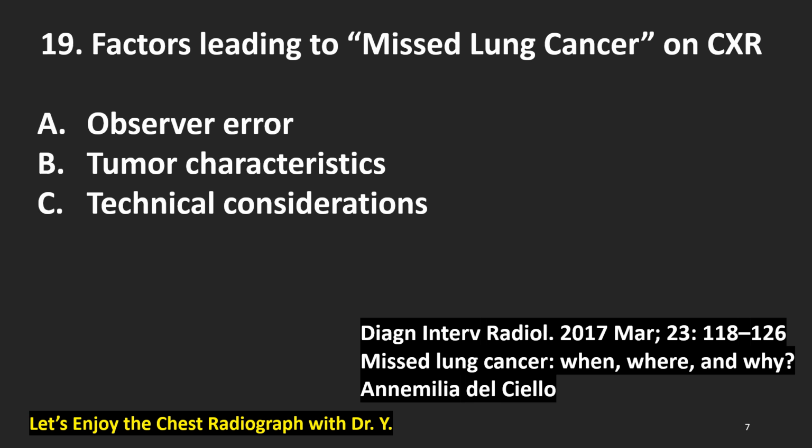Let's enjoy the article which I previously recommended to you. Factors leading to missed lung cancer on chest radiograph. A. Observer error, which means I made a mistake. B. Tumor characteristics. C. Technical considerations.